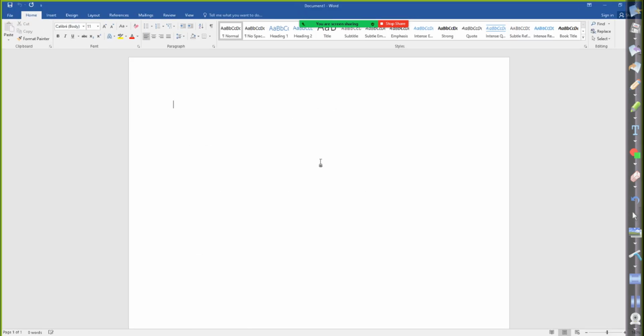All right, so our MR system has three magnetic fields. Let's start with our first, our static magnetic field. And that's denoted by what? B0. Okay. All right. So there's no biological harm that the static magnetic field can do to our patient, right? It's a very strong magnet, but ultimately there's really no biological effects.